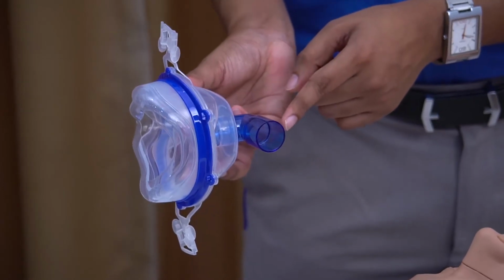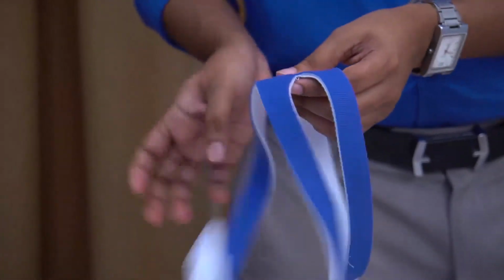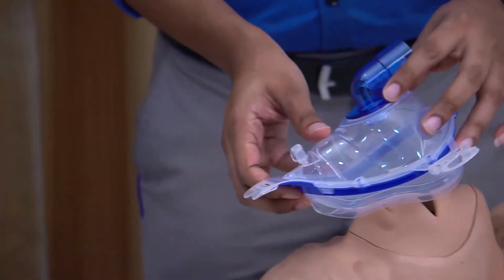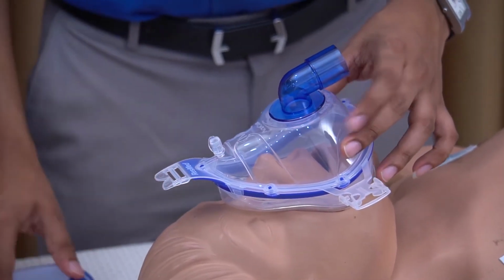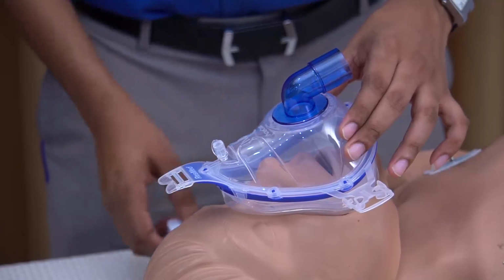There are several loops to connect the mask to the patient's face using a harness, which we will demonstrate soon. The mask should be placed over the patient's mouth and nose, and this part should be directed to the head end of the patient. Once the mask is fitted to the patient's face, there should be no or very minimal leak.